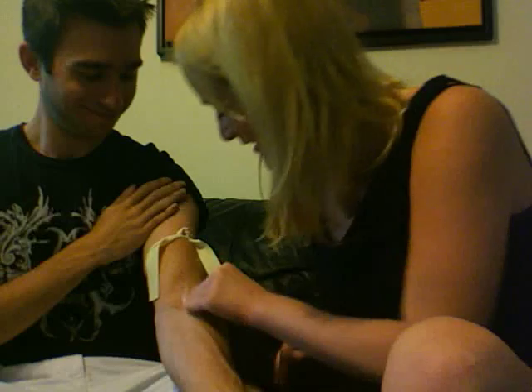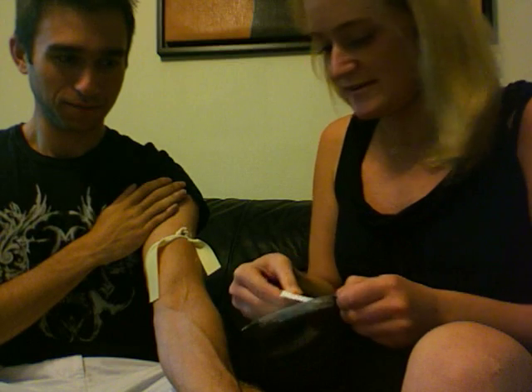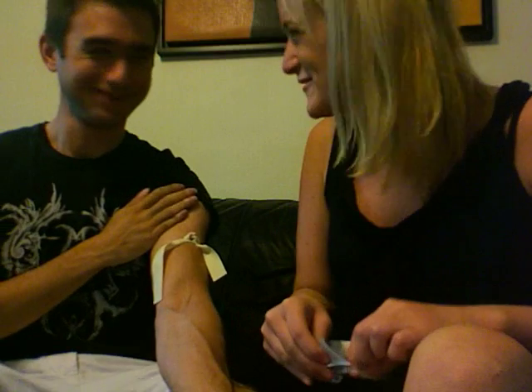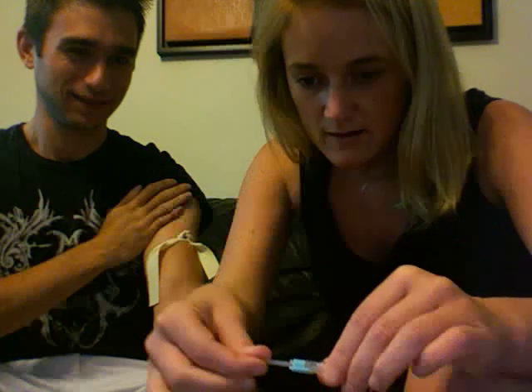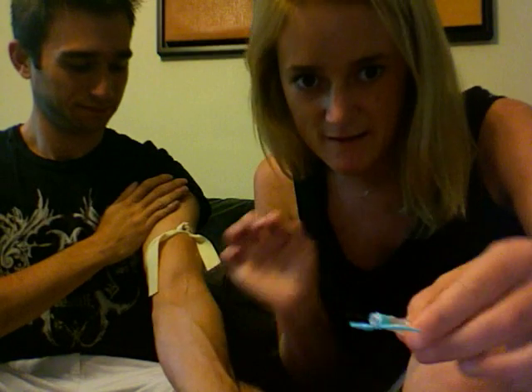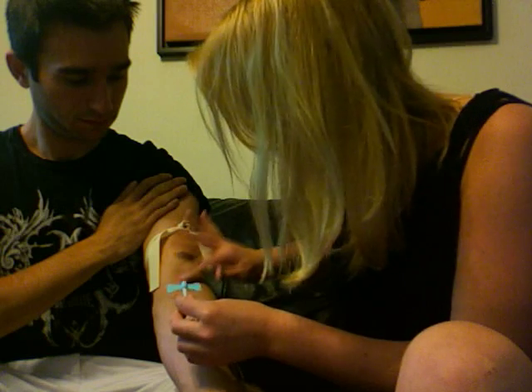You got a little sunburn in there. And now I'm going to open the butterfly needle — that's what we call it as doctors. The nurses usually use it more than we do. And I'm going to untwist. Okay, needle. And I put the long end down farther and right into that big vein right there.